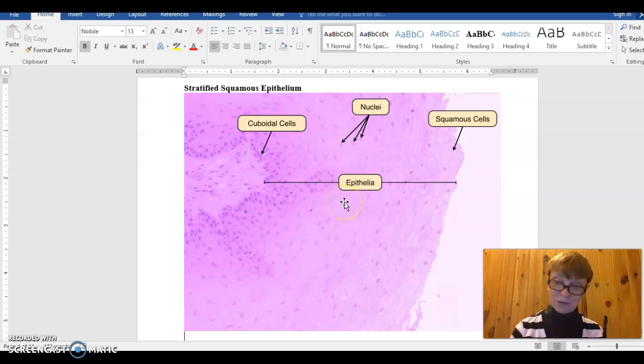What they do show you, interestingly enough, is that although we want you to focus on this, in this particular slide, they're showing you the reality that you will have squamous tissue, basement tissue, and oftentimes columnar or cuboidal attached to that. So here they're showing you that there is some cuboidal on the edge, but in the slide that I give you for the squamous, it has predominantly just squamous tissue, so it'll be a little bit easier for you to identify that.